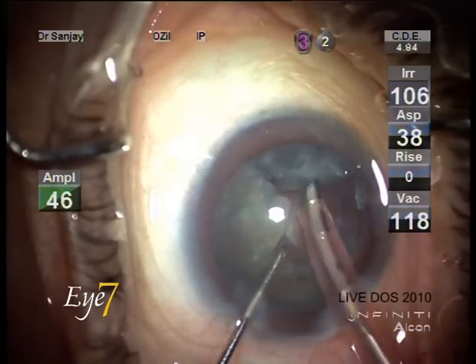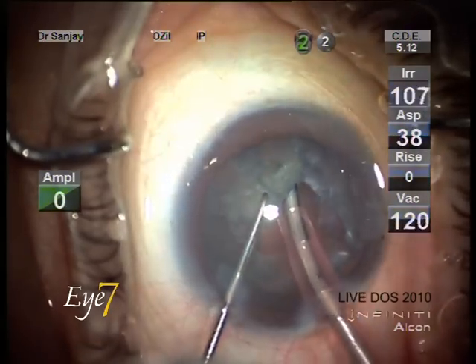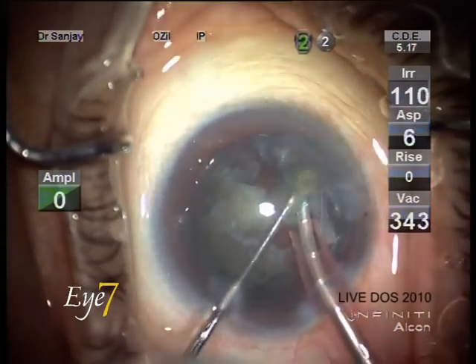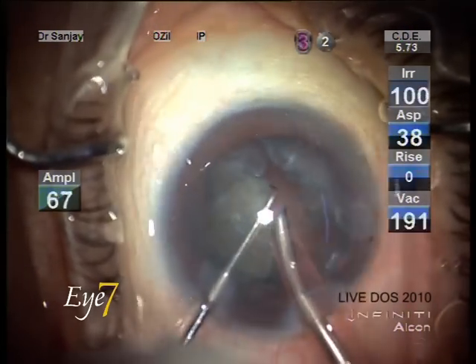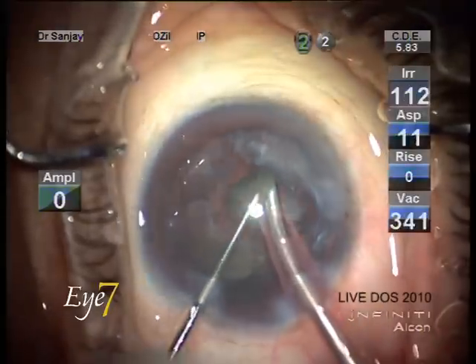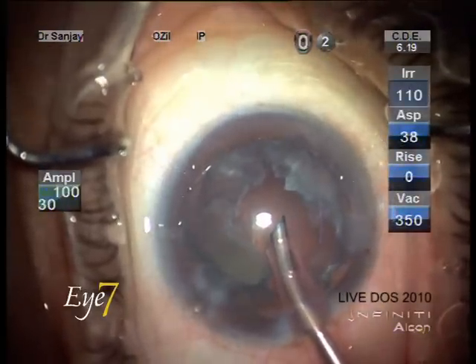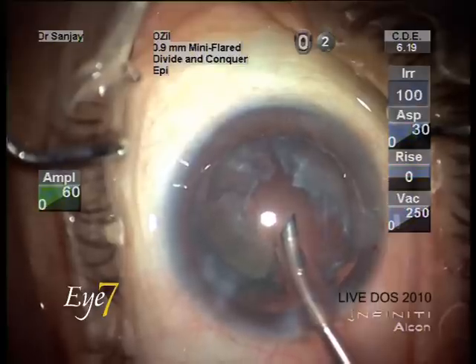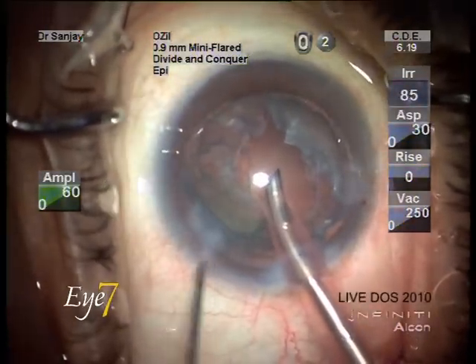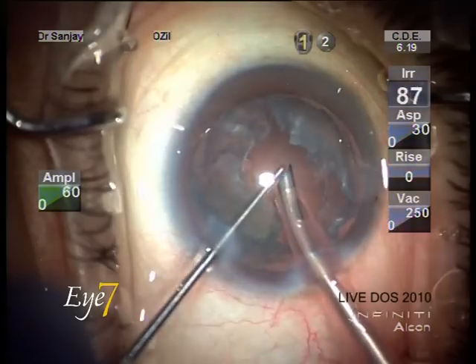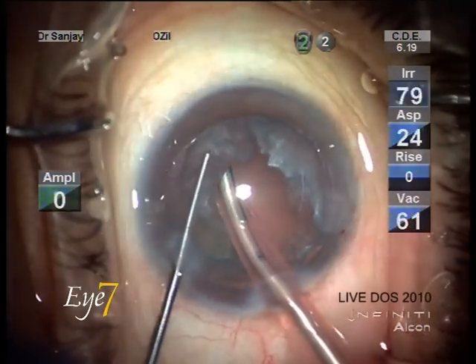Notice the stability of the chamber — even with the vacuum setting at 350, there is no surge or collapse of the anterior chamber. Notice the position of the Kelman tip, which is a 45-degree bent tip. This tip is lying sideways and not pointing towards the back, because if the tip points towards the back there is a risk of posterior capsule touch and rupture.